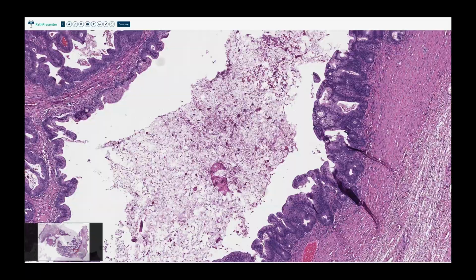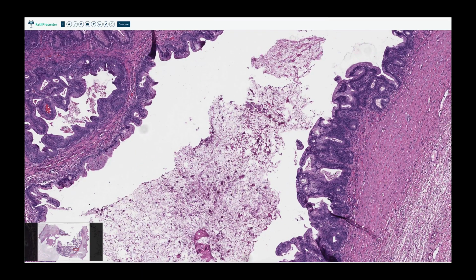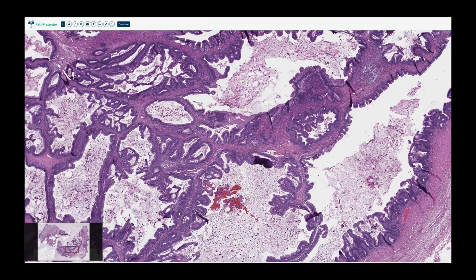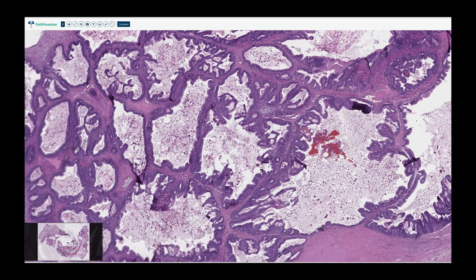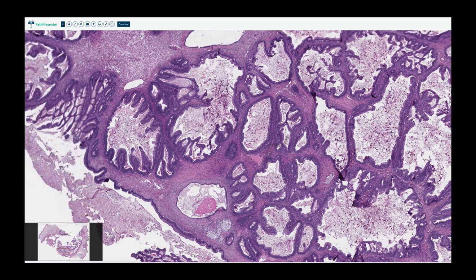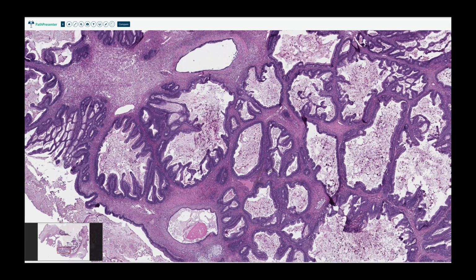And when you're looking at mucinous borderline tumors, what do you want to look for? You want to ask yourself, okay, I've decided this is a borderline tumor. Now, is it carcinoma? How do I get to carcinoma? Well, there's a couple different ways to get there, like we talked about in the video. Intraepithelial carcinoma, which carries a different prognostic implication for mucinous carcinoma, sort of de facto. So what do you want to look for in mucinous carcinoma that's not intraepithelial? Confluent glandular architecture, kind of like you think of for an endometrioid proliferation. Are the glands touching? Is there an invasive pattern, like clear invasive foci diving into the stroma?